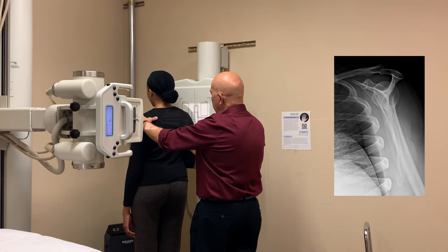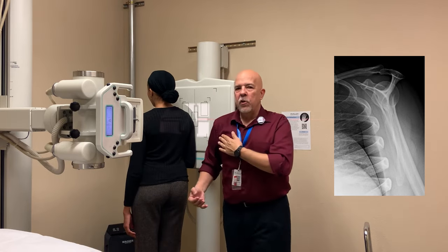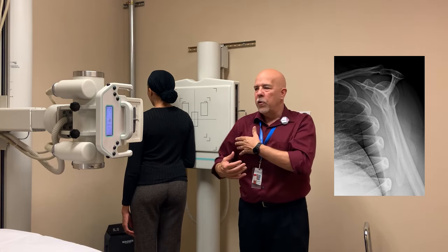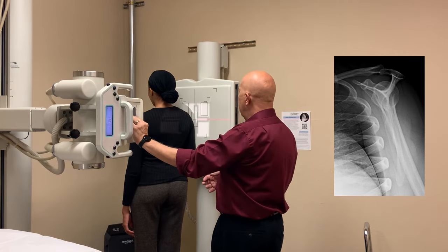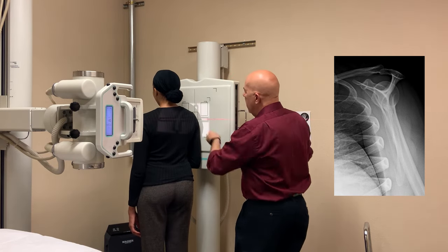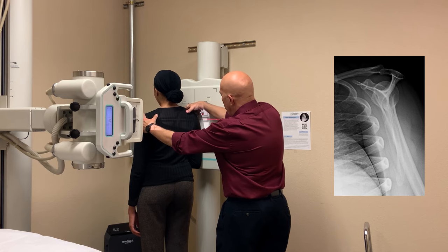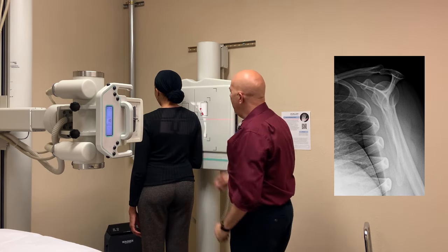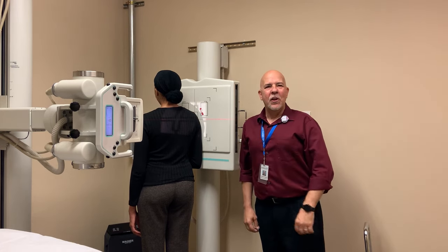A little bit right there. Now, it's important to make sure you don't roll the shoulder forward — that will bring the scapula forward and it will also close up that joint space. I'm going to have you come backwards towards me just a little bit. Place your marker, and good collimation is always important. And shoot your film. We're good to go.